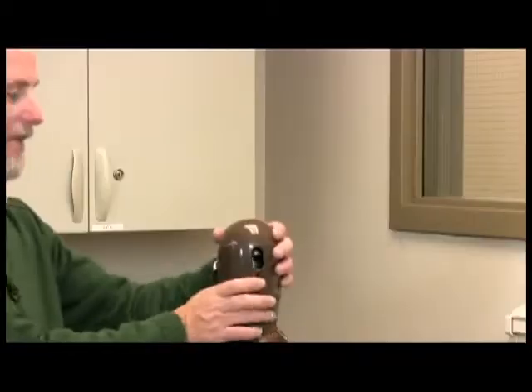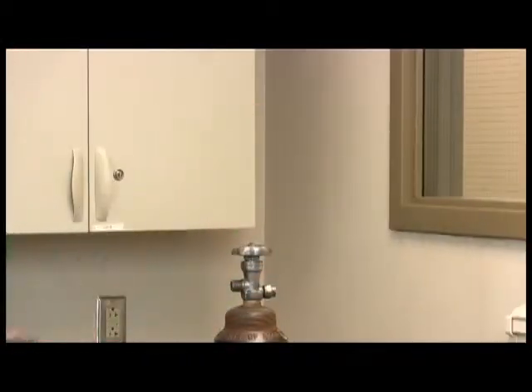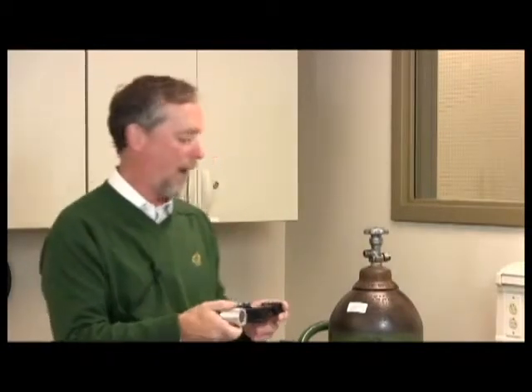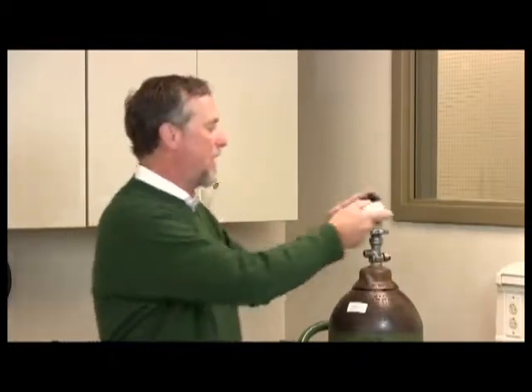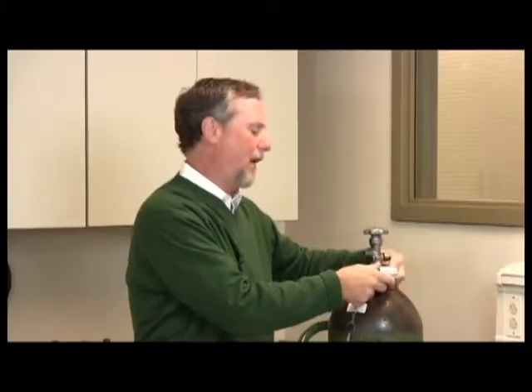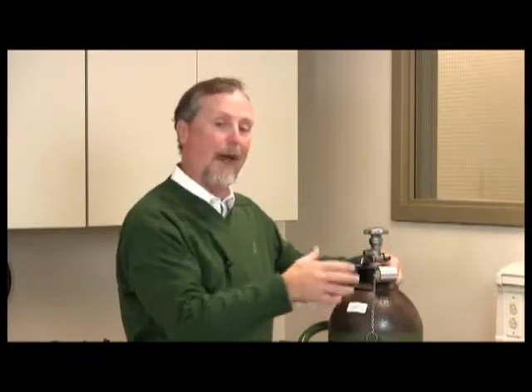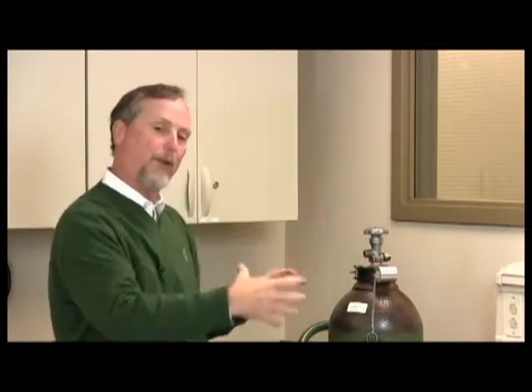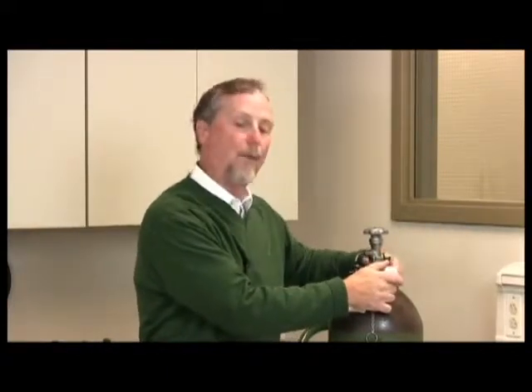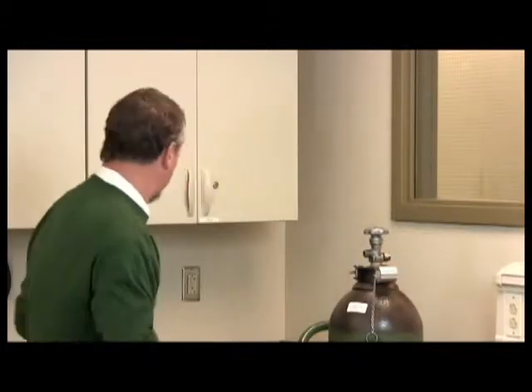Okay, now we're going to cover the actual installation of the Heliox blender onto the Heliox cylinder. So what we'll do is we'll remove the cap. And we have a clamp, and this clamp is to interface the pole that's going to hold the Heliox blender on here. When this is ordered as a kit, there actually come 2 clamps so that when you bring your new cylinder up, you put the clamp on, you move the regulator over, and then you can take the pole and move the whole setup over to your fresh tank of Heliox.